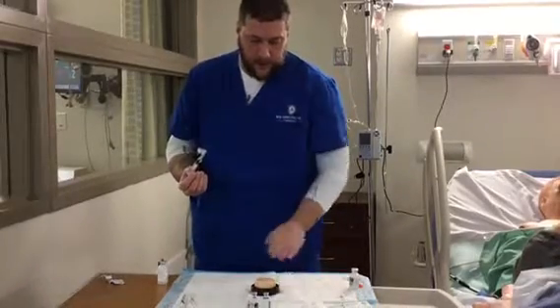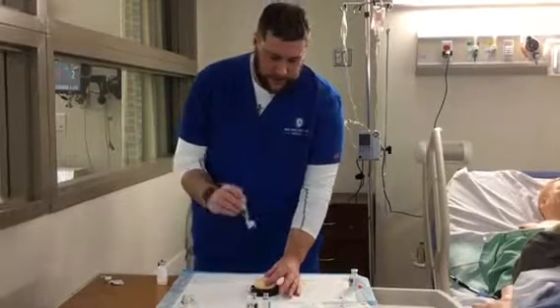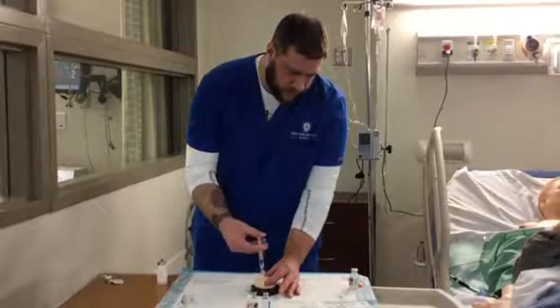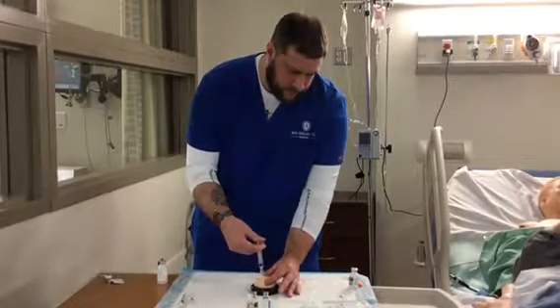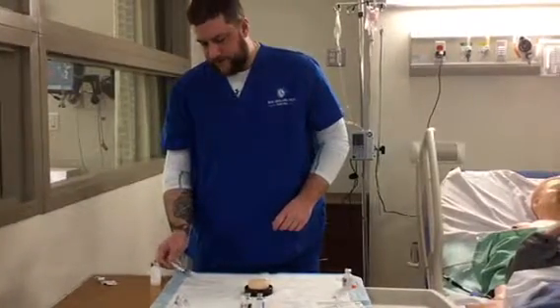For this one here, again, we would clean the site. You want to actually push up on the skin. You want to insert straight in, withdraw, relax, and straight out. Again, discard in the correct location.